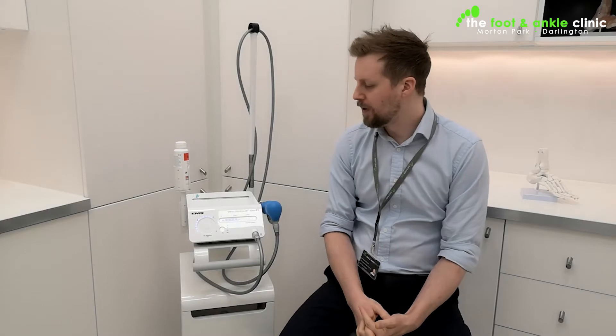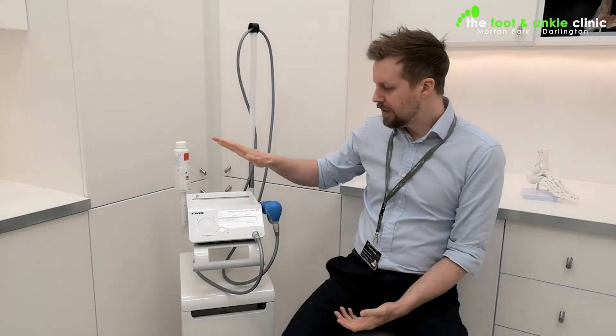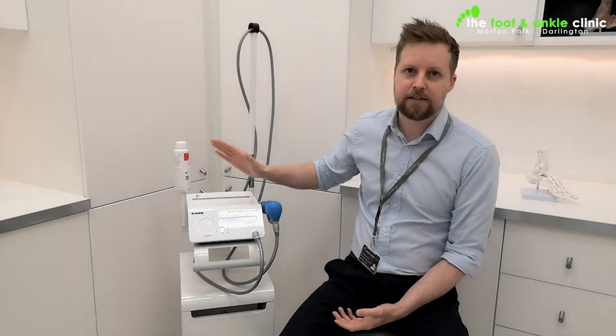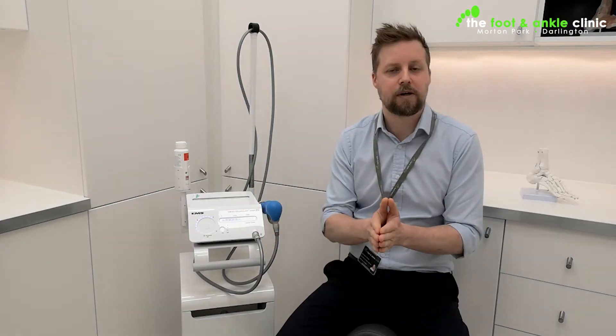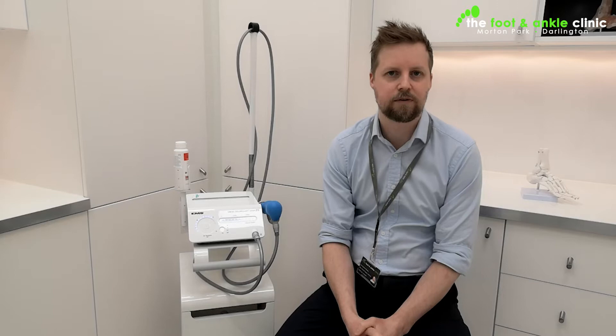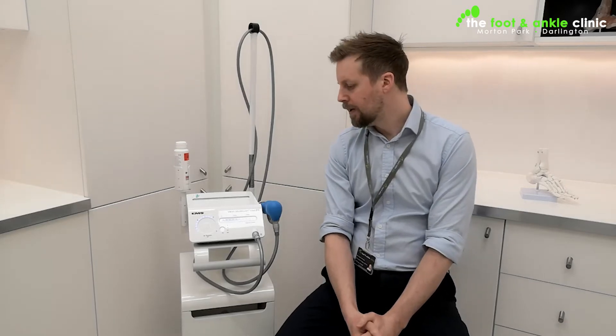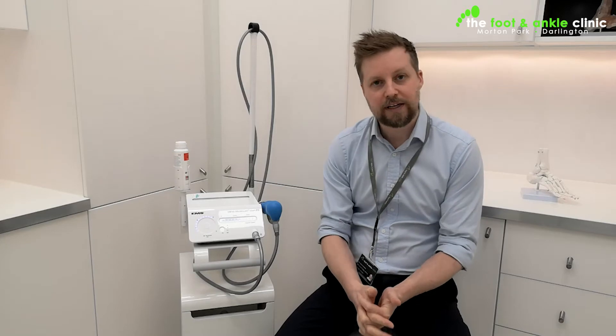Bit of a mouthful. What does it actually mean? This piece of kit here is a fantastic, state-of-the-art shockwave system. It is the same system that all of the Premiership football clubs use and all the England rugby team use. It's used in the Olympic Stadium for all the Olympic teams at different points. Basically, it is the top piece of kit that you can have for it — that's why we've got it in.